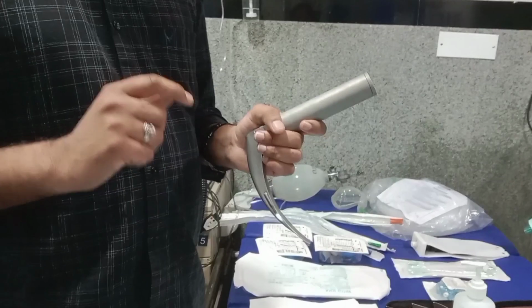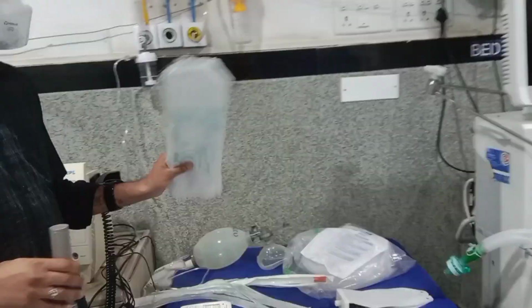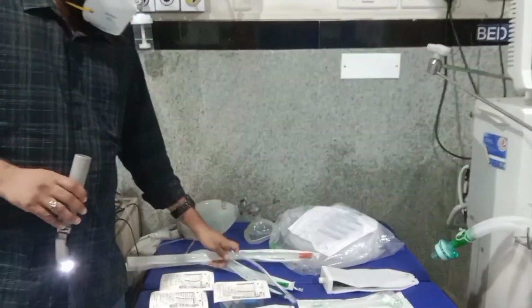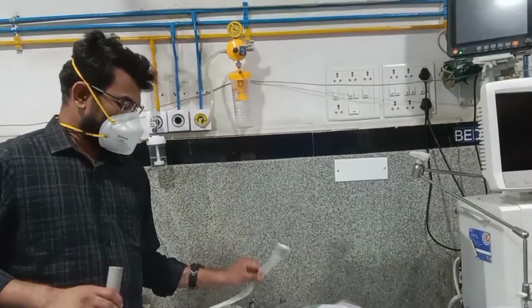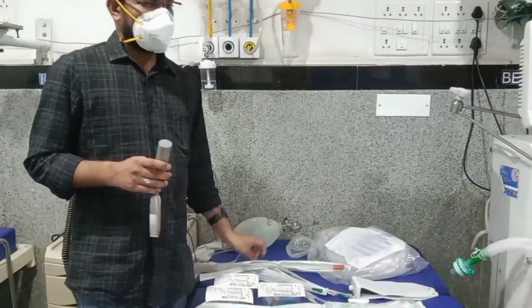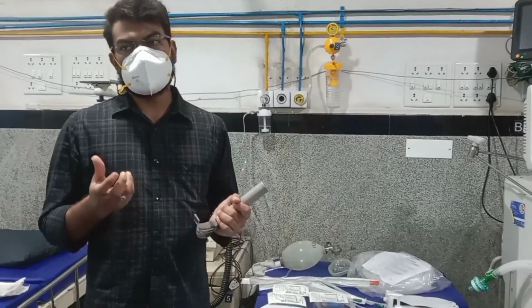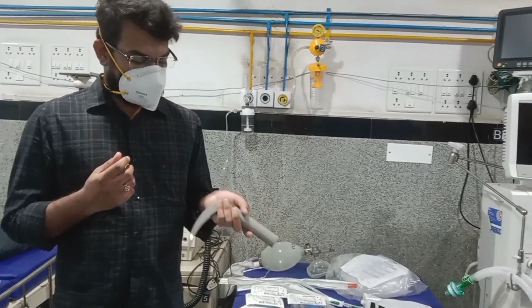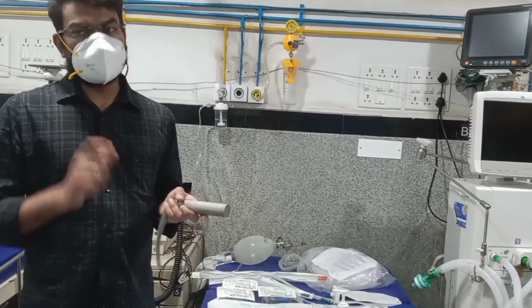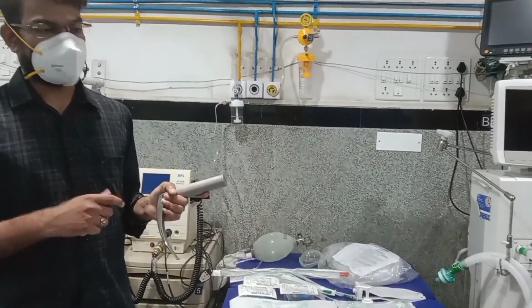We should also make sure that we have suction. The suction tube should be connected to the suction, and we have a suction catheter connected to the vacuum suction. After putting in the laryngoscope, we do suction, so that there is no residue or fluids, or if there is any bleeding, the cavity should be clean and it should be visible. We do suction for our vision.